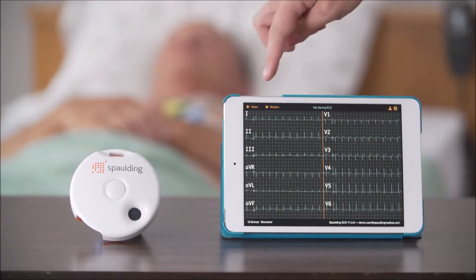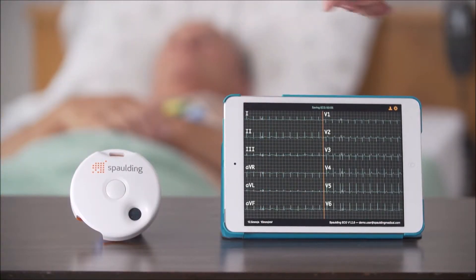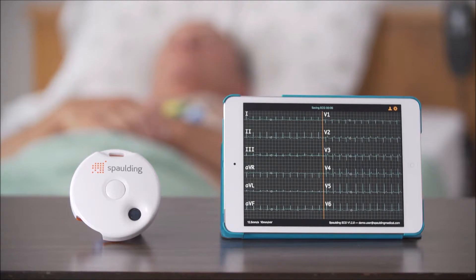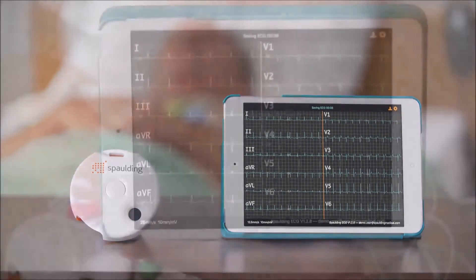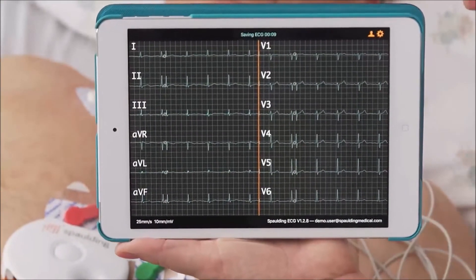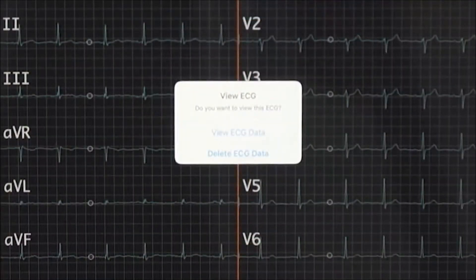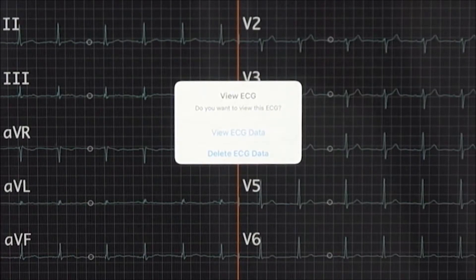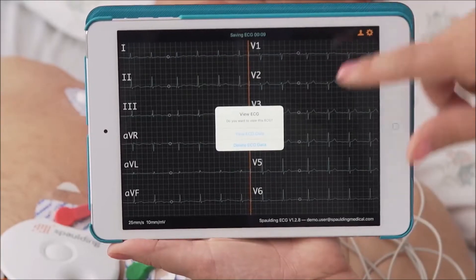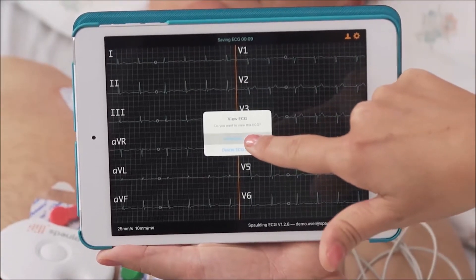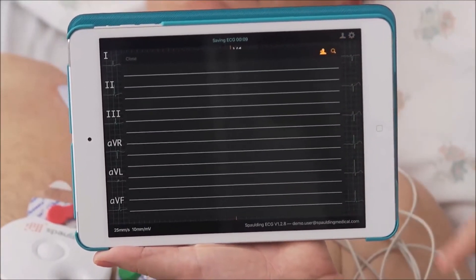Press the 10-second button. The app will always record the previous five seconds and the next five. Once the 10 seconds is up, you will either view or delete the ECG. Click View ECG Data to continue.